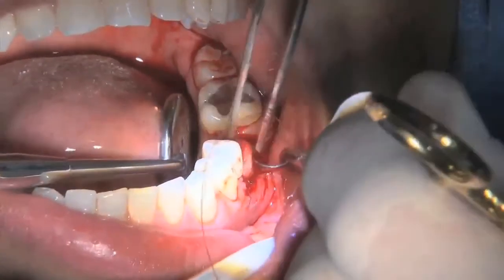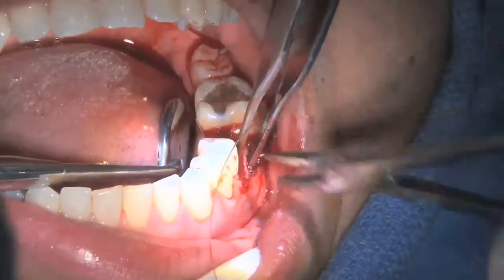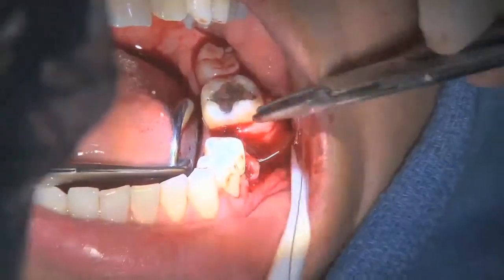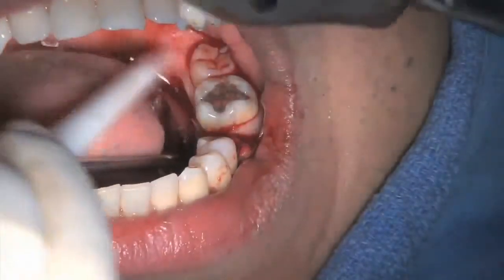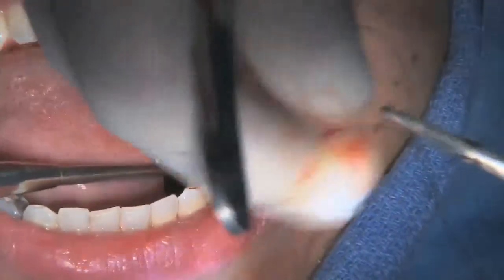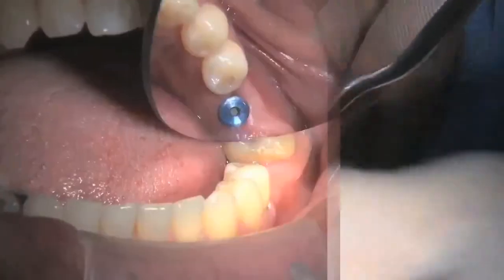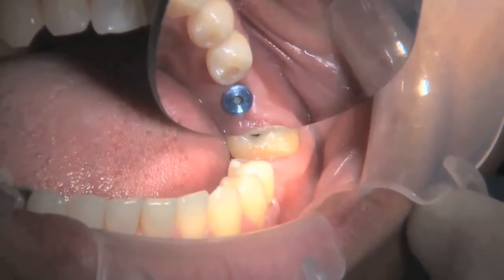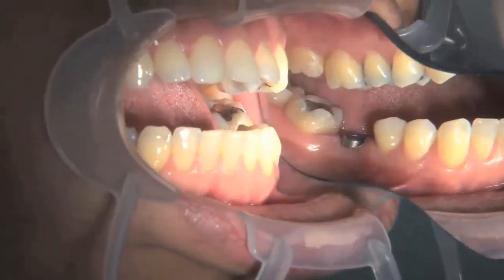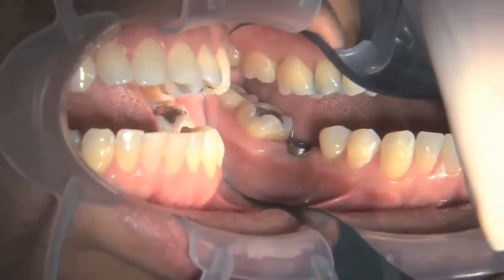This case could have been immediately loaded due to the dense bone and very good stability, but I opted not to immediately load the case due to the grafting which was being placed, and we might get better healing without the immediate load. This is a view of the site at 2 weeks post-op. Notice the rapid healing and lack of inflammation in the area.